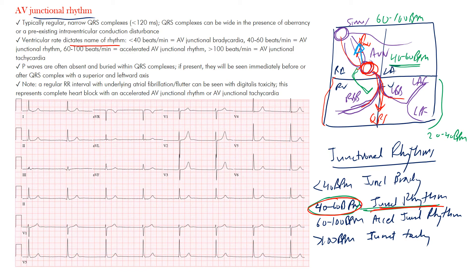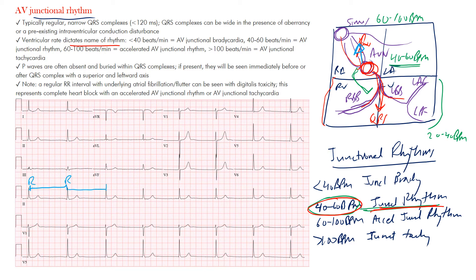Here is an example of a junctional rhythm on an EKG. Looking at lead II, notice there are no P waves before any of the QRS complexes — normally a P wave would precede each complex but none are occurring. The rhythm is regular: the R-to-R intervals are all the same duration. The QRS complex is narrow, consistent with junctional origin.